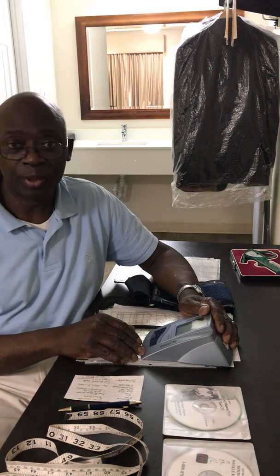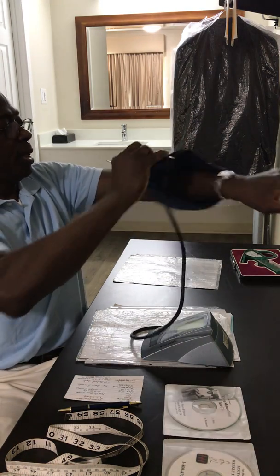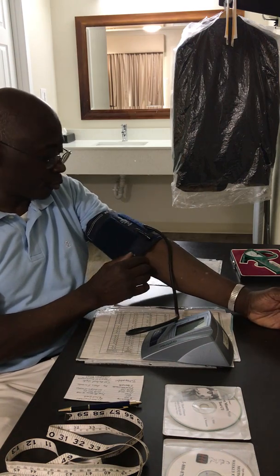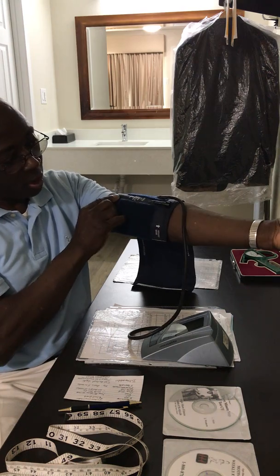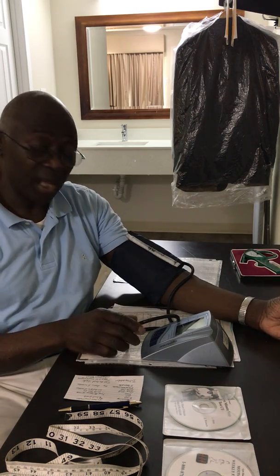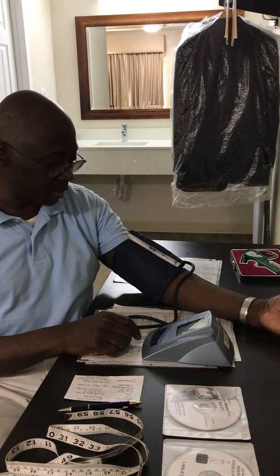As long as you have an electronic unit that is consistently ten points off, we can live with that and make an adjustment. With the MicroLife unit, we put the cuff on and look for the brachial artery. For some reason, women tend to be a little more off-center toward the inside of the arm than men. Get the arrow aligned with the brachial artery — roughly in line with your pinky finger — tighten the cuff, not too tight, and get the reading going. Ideally, have the arm at heart height.